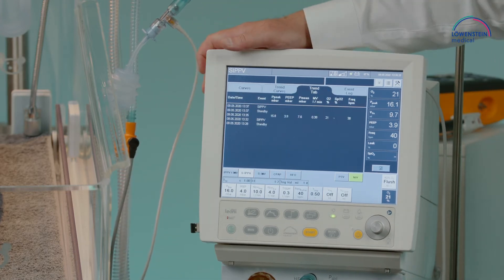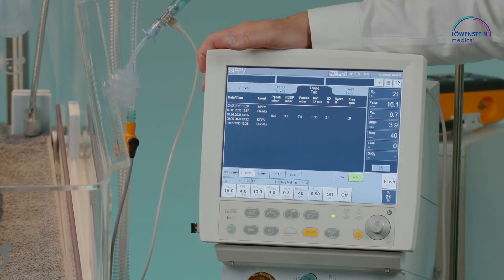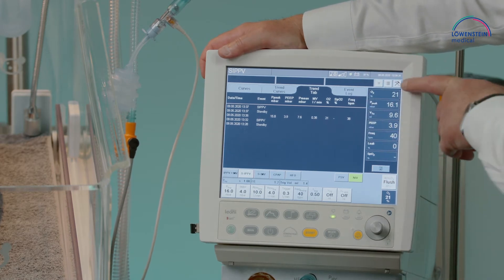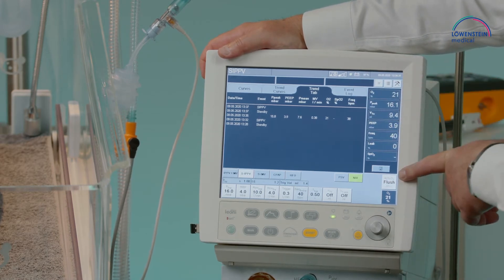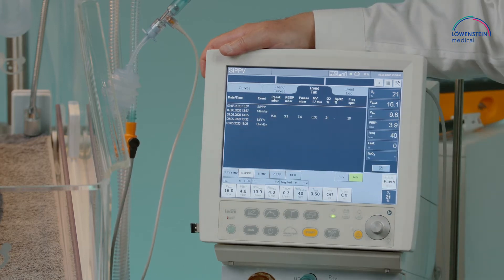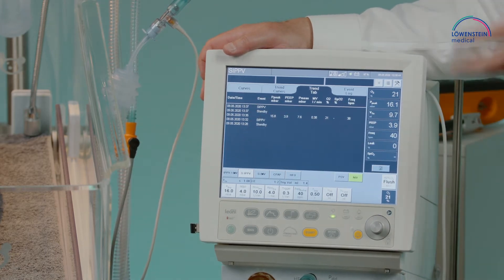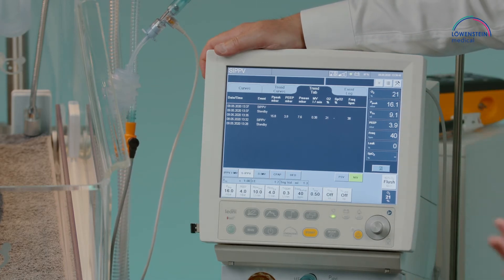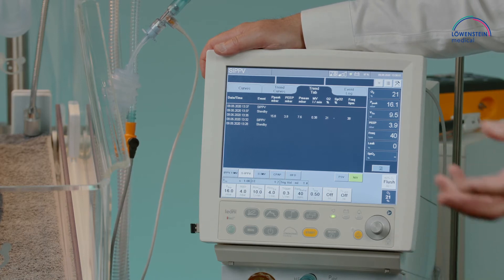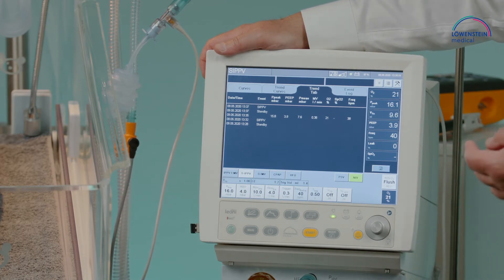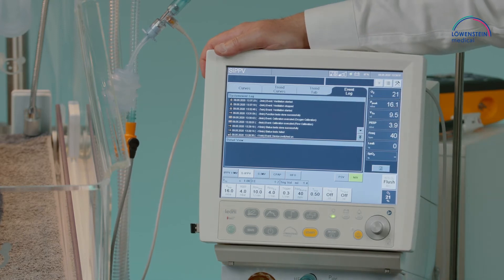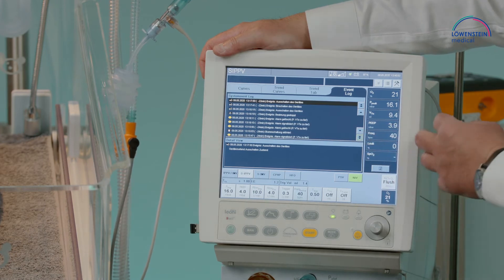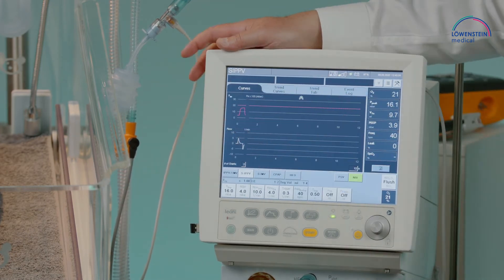In addition, we have a tabular trending that records all measurement information, taking a measurement at a timestamp every five minutes. It also shows the complete information about when you started the system, what settings were used, and so on. The event log shows this completely as a catalog — a full memory of up to four and a half thousand scrollable messages.